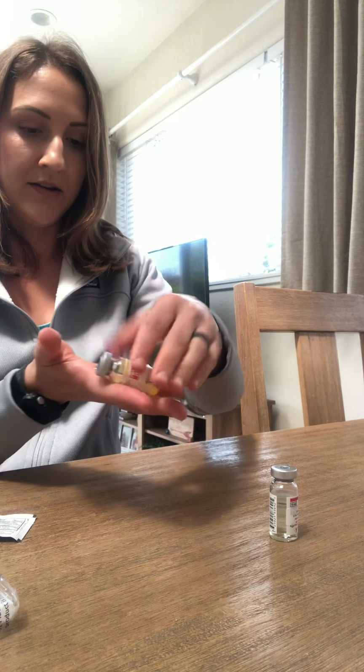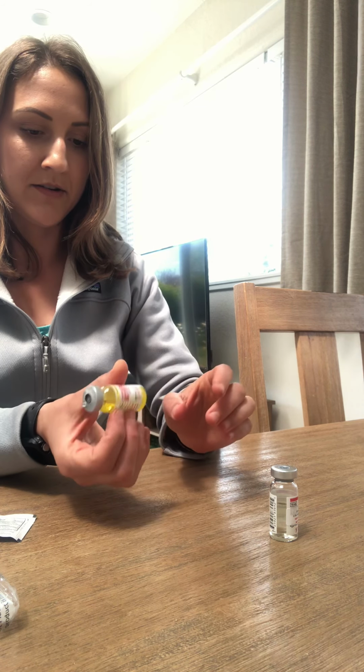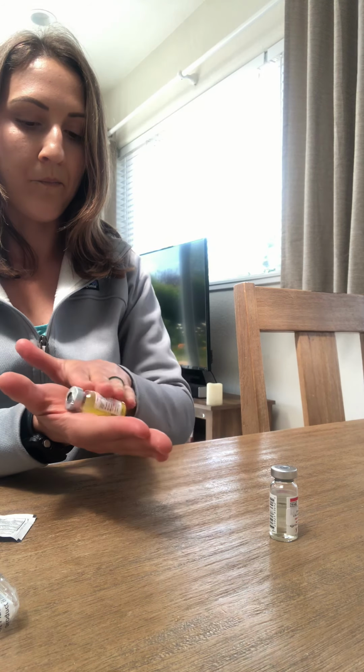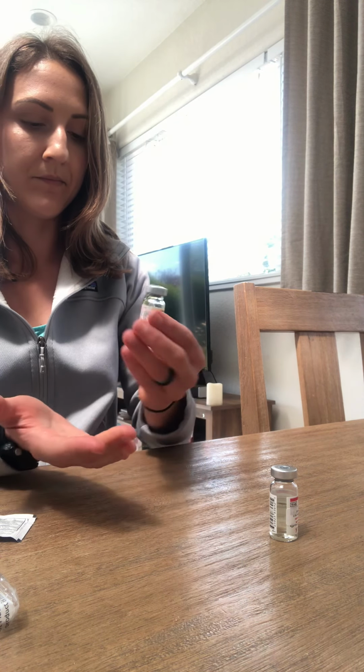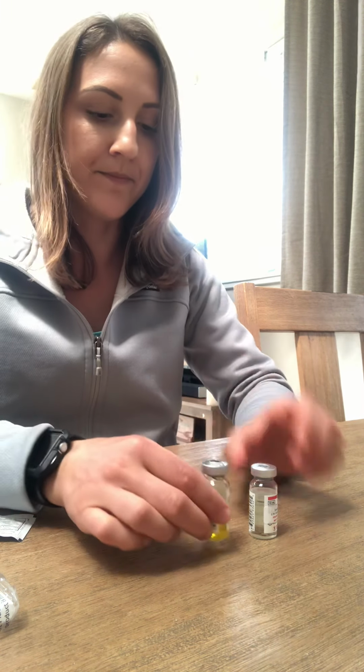Making sure everything is nice and dissolved. Once it's all dissolved, I'm going to be doing any medication calculations that I need at this time. I'm going to be determining the concentration of the medication.